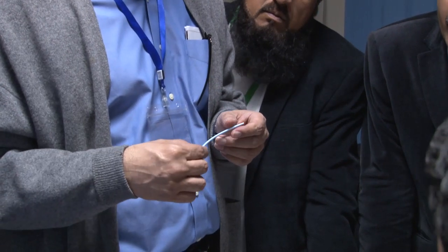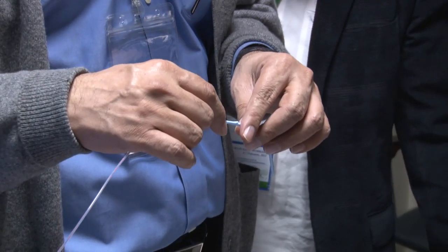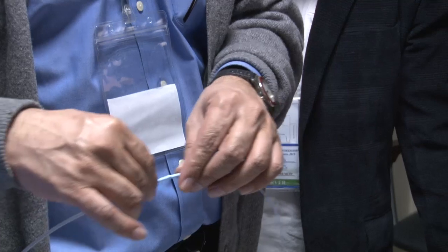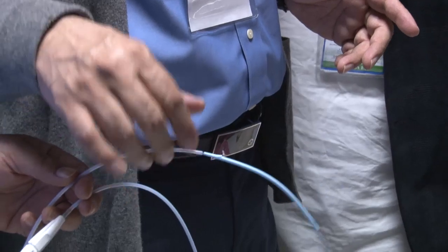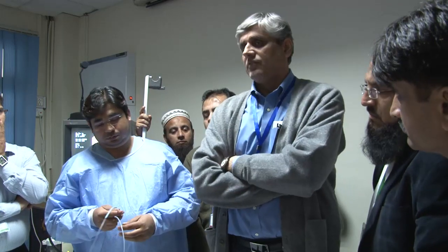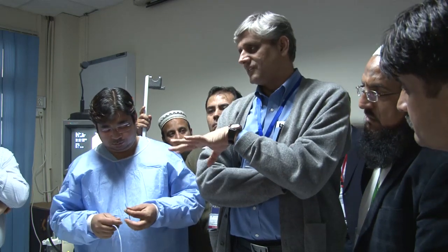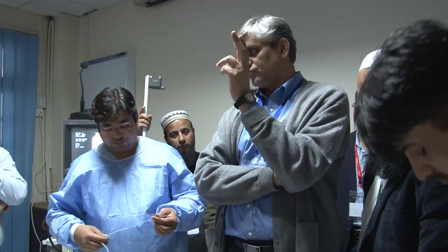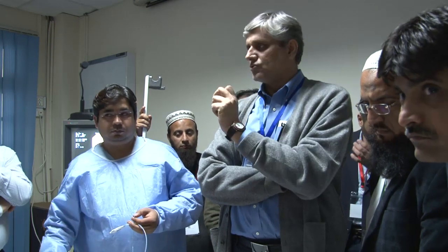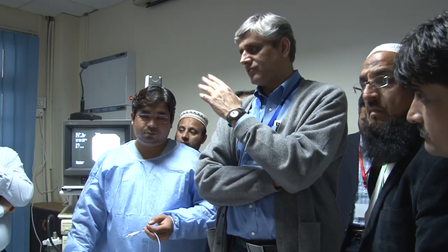And that's important. Otherwise, अगर आपने sphincterotomy नहीं की हुई, again that's something that we haven't discussed. I'm sure I'm the odd one out maybe. I do more sphincterotomies than recommended. All my stents are placed after sphincterotomy. We are a teaching center, so once I've got access, I do a small sphincterotomy, and that's the only time that I do an incomplete sphincterotomy. I won't do full, just so that if my junior loses the access, I don't have to go through all the things.